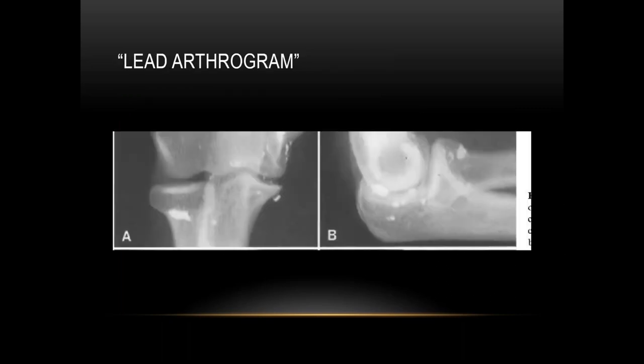Here is an example of a lead arthrogram — an x-ray of an elbow demonstrating hyperdense lead material around the joint space.